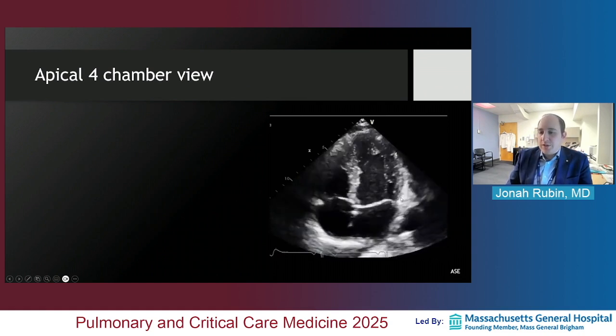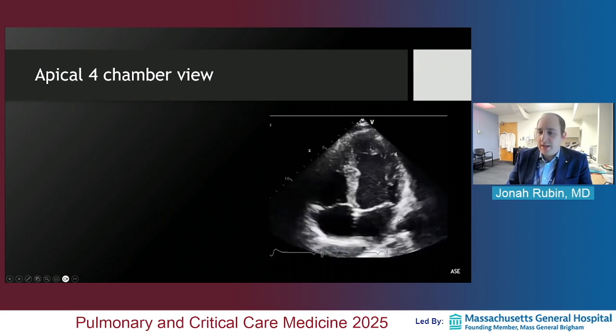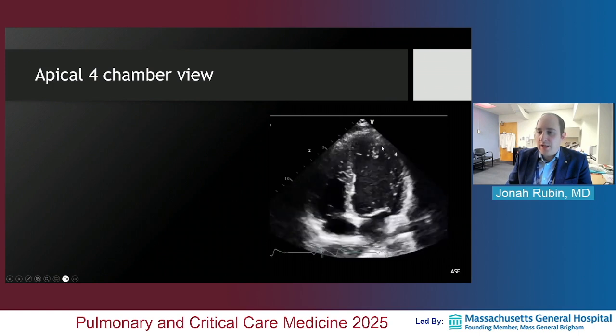So let's focus first on the left ventricle. You can see here more of that longitudinal movement, that myocardial excursion. And again, through all these segments, you can also see the thickening.